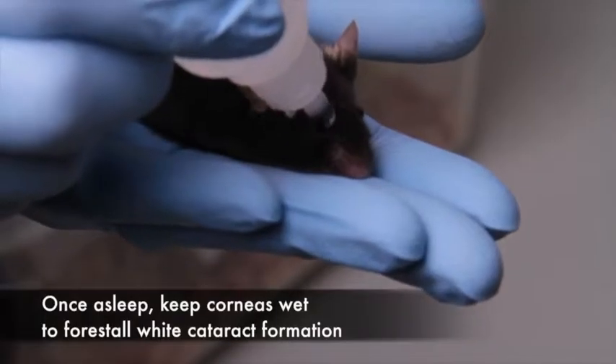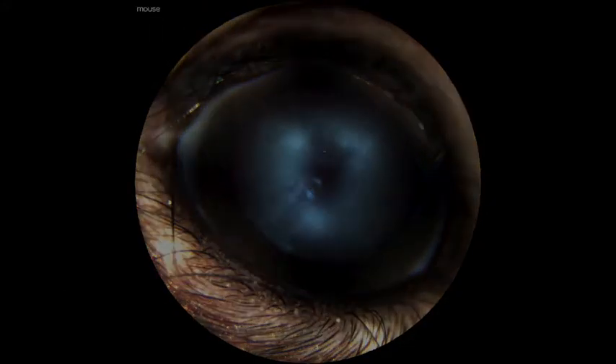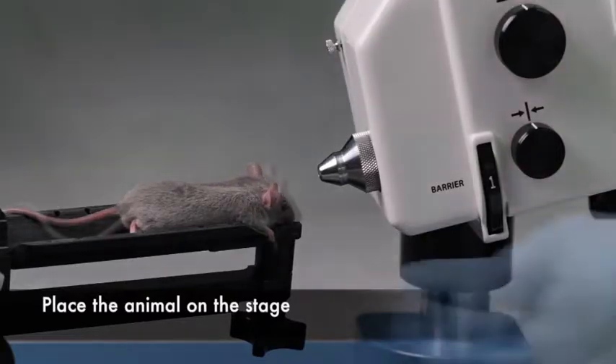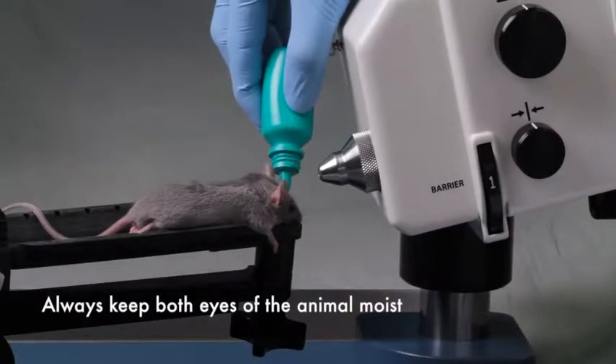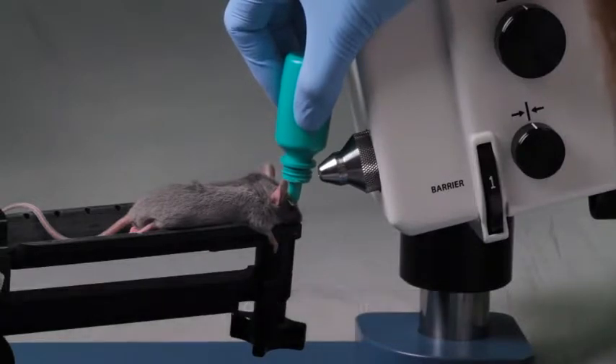Once the animal is asleep, keep the corneas wet. This will avoid the formation of white cataracts, which will obstruct your view. Place the animal on the stage with its nose advanced forward. If necessary, add drops of saline, gel, or tears to keep both eyes of the animal moist.